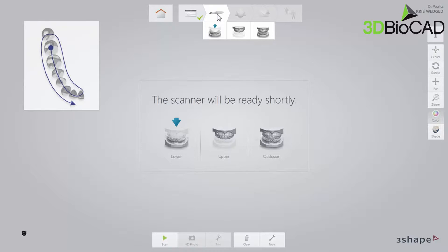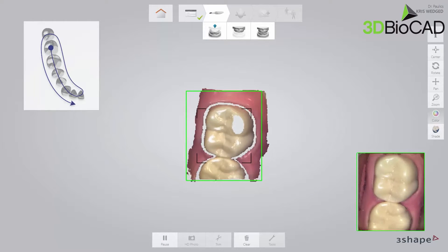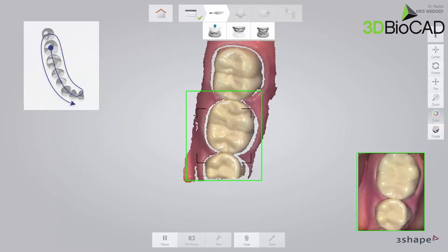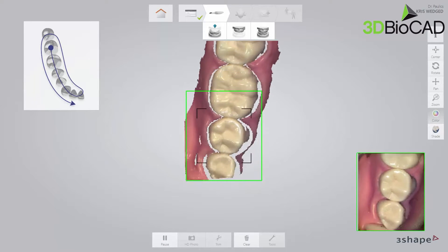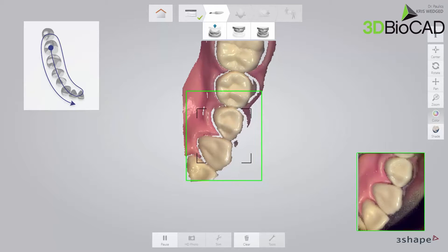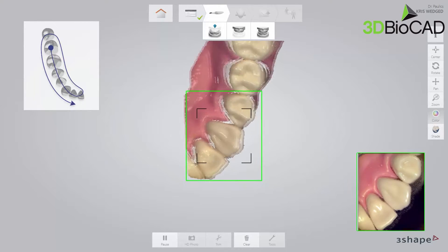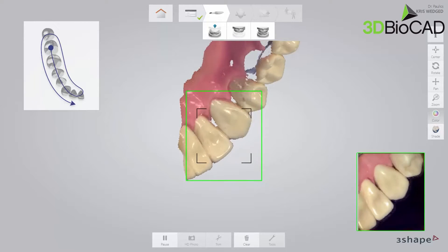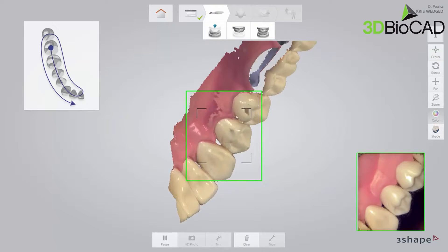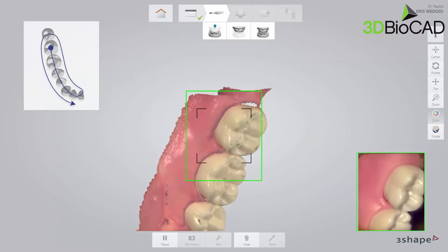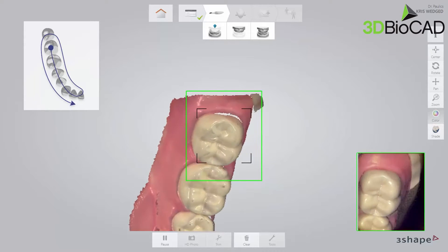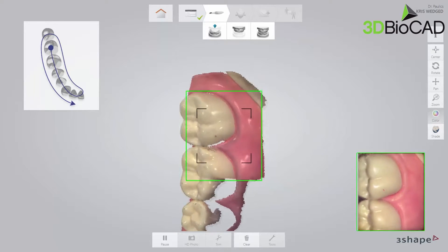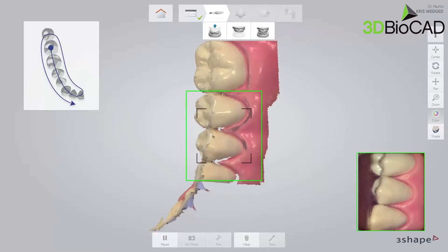Start by scanning the occlusal surface from the molar to the canine. Then, as it is the lower arch, slowly roll to the lingual side and move the scanner in the distal direction. Finally, slowly roll over the last molar and scan the buccal side.